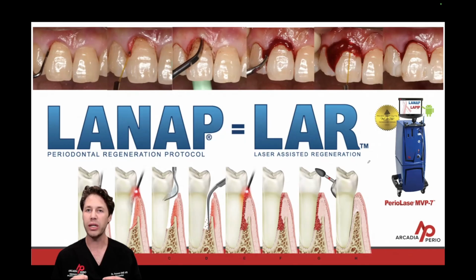In step G, we're going to do our occlusal adjustment, making sure all of those traumatic forces are removed, because bone regeneration won't happen on a tooth that has mobility. So if we can control for the etiology of the periodontal pathogens and for the traumatic occlusion, we will get bone regeneration in the anterior aesthetic zone with minimal tissue shrinkage.